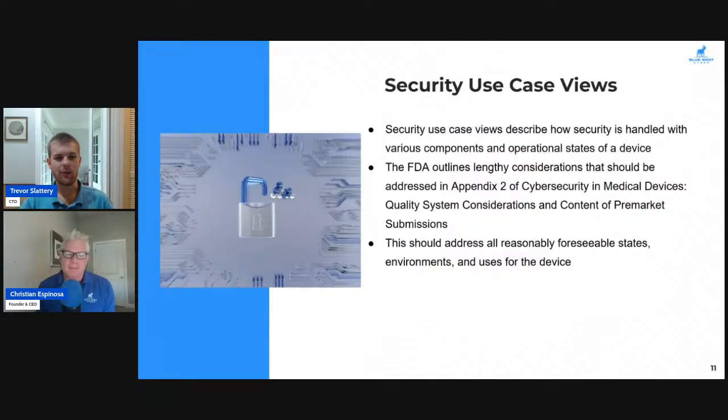And then I'll go back to the situation you talked about earlier where we can load in our own operating system. If we can redirect what that BIOS is doing without protections, we're going to go all the way around the considerations for the kiosk mode. We're just going to bypass it altogether and still get access to sensitive information. Because we can change the boot order in the BIOS if it's not password protected or somehow has security around it, is what you're saying, and then make it boot off of our thumb drive. Yep. And at that point, it's a pretty dangerous situation. We're able to access any information stored on the device in any way that we want to see it.